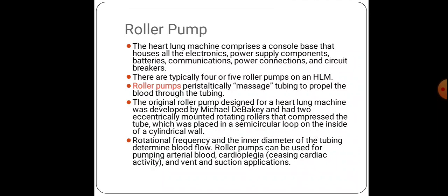For this we mainly use the roller pump, which is also called the peristaltic pump. The roller pump peristaltically massages, which means it compresses the tube to propel the blood through the tubing.